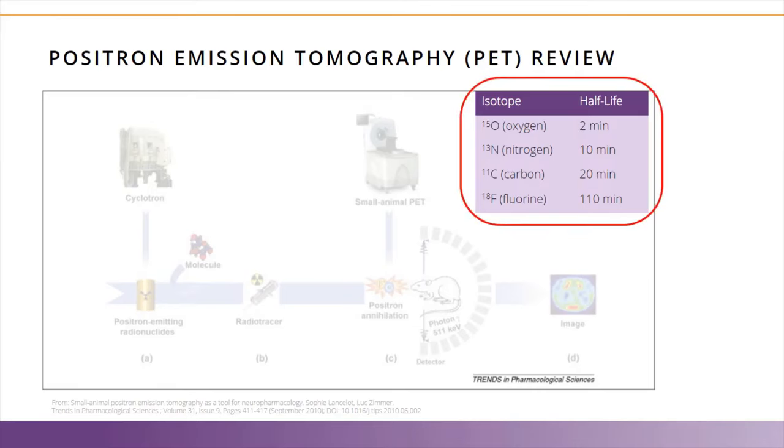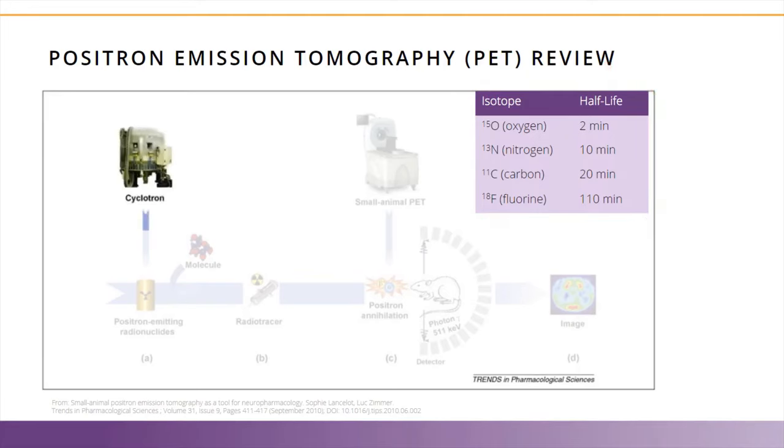There are a variety of isotopes which are commonly used in PET imaging. That is because they emit a positron during their decay, which sets off an annihilation event and results in gamma rays that we spoke about on the previous slide. Important to note, however, is the half-life of these isotopes. When short, the radioactivity will decay very quickly and the tracers will not be useful for long after it is made, so one must be very close to the source. Typically, radioisotopes used in PET imaging are manufactured in a cyclotron.